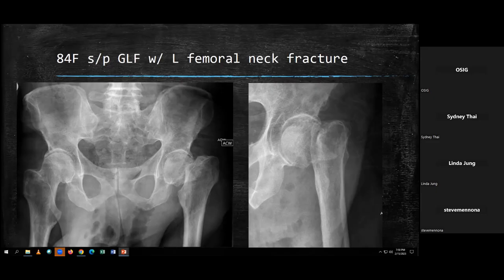So we identified the fracture here before, right? That's what's going on. If you look at this, those lines don't really match up. What's happened in this case is not that there's an extra piece of bone, but the bones are now completely free. That helps to highlight the displacement factor there. They're completely separate, completely displaced.